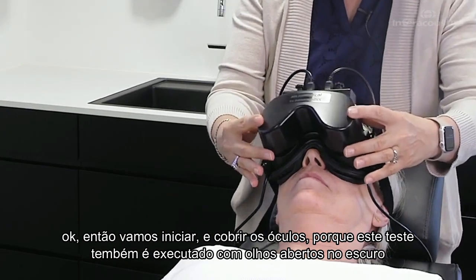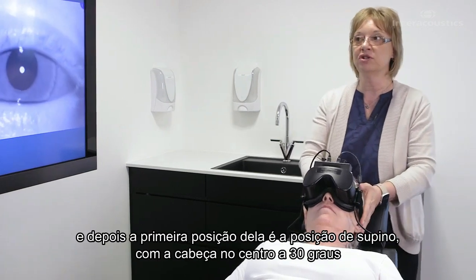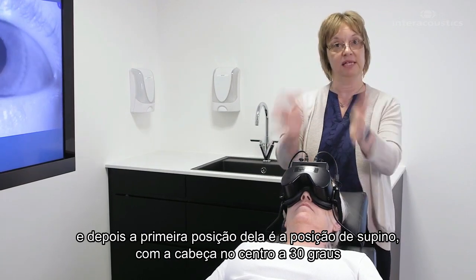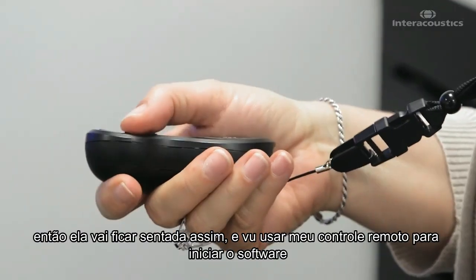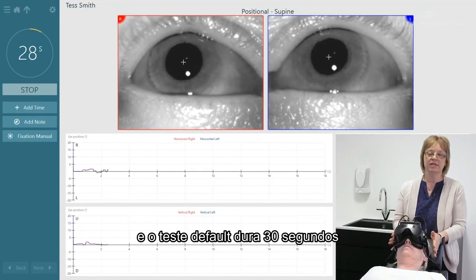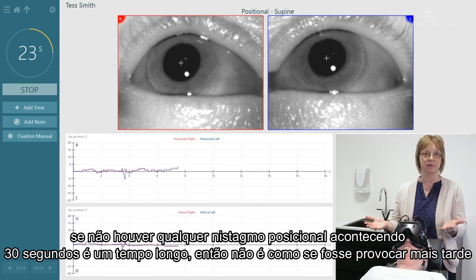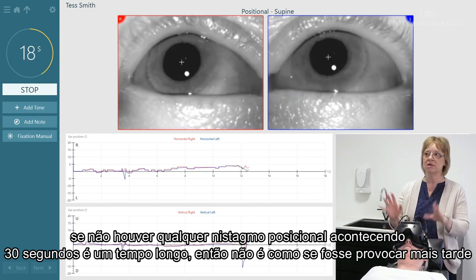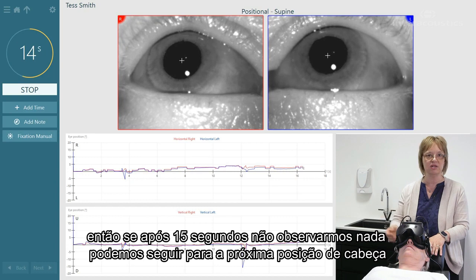This test is also done with eyes open in the dark, so I'm going to put the cover on. Her first position in the positional test is supine at 30 degrees, head center. I'll use my remote control to start the software. The test defaults to 30 seconds, but if there isn't any positional nystagmus, 30 seconds is a long time — so after about 15 seconds, if I don't see anything, I'll continue to the next head position.